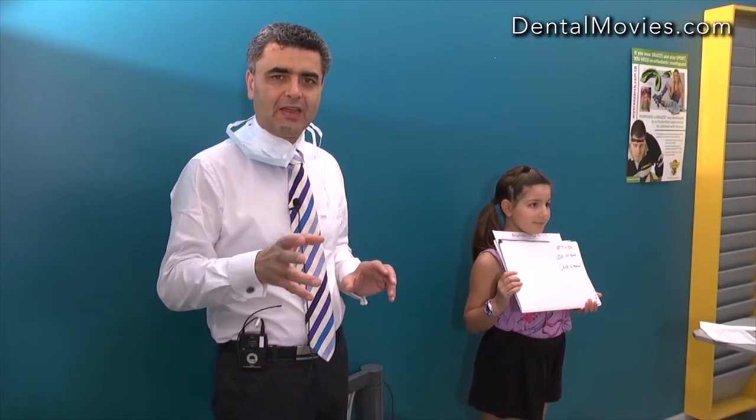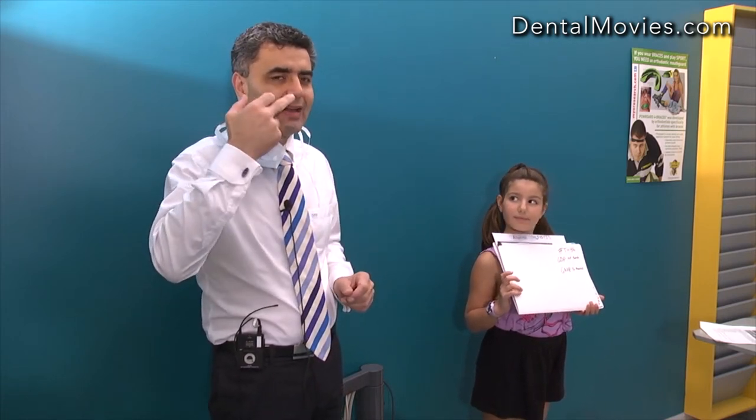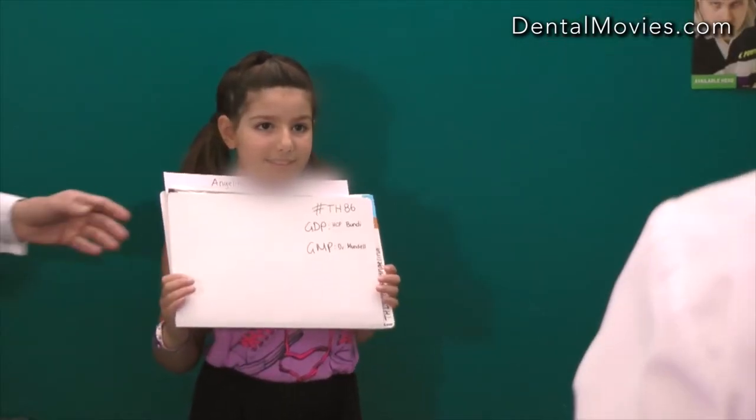The first photograph is just the photo identification — we ask the patient to hold the file so we know where the records will end up. Then we take the first of six extra-oral photographs. The first is the natural posture shot, which is very important because some children's natural posture may show airway-related positioning. We want to record that natural posture, not have the child pose for the camera.